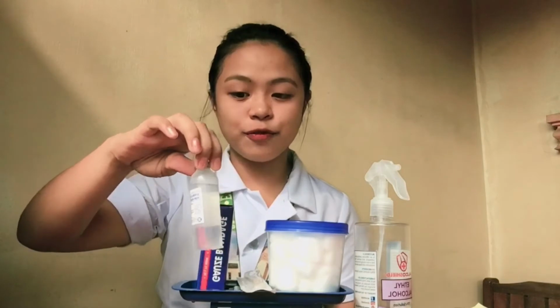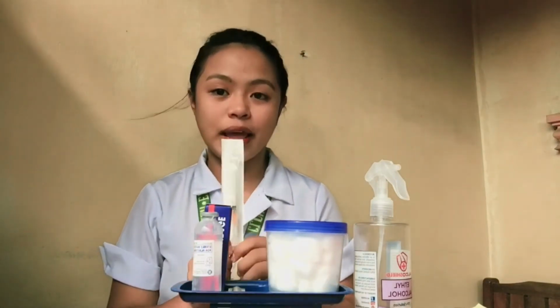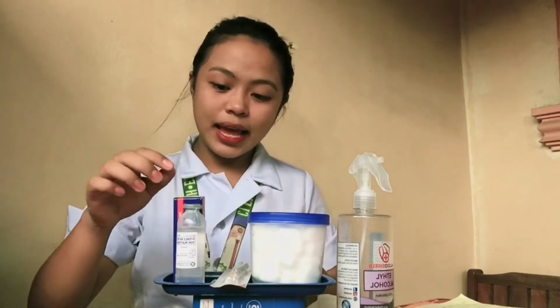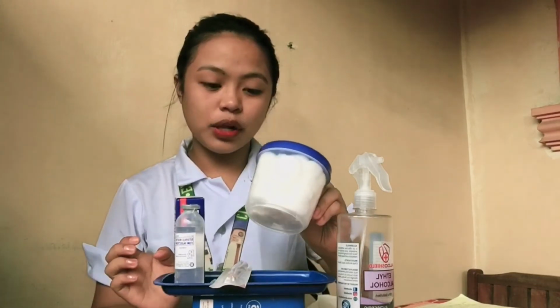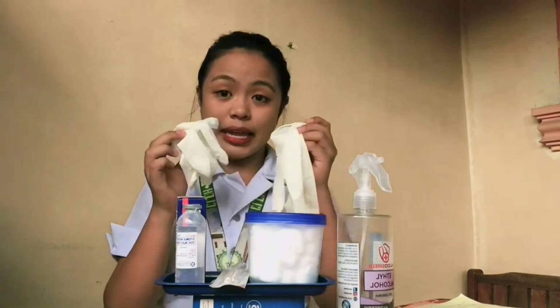First, we need our sterile water, a syringe that measures 1 cc or 1 ml, and our aspirating needle for the withdrawal of the sterile water for the skin test. We also need a gauze or bandage if necessary, clean cotton balls with alcohol for the antiseptic technique, and clean gloves.